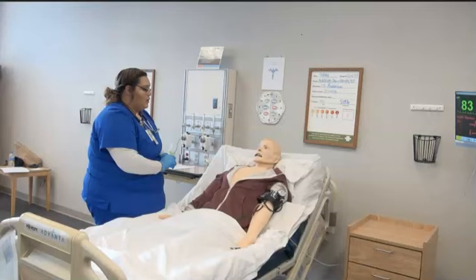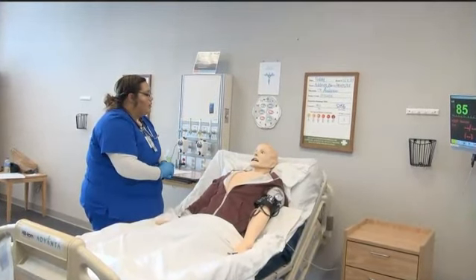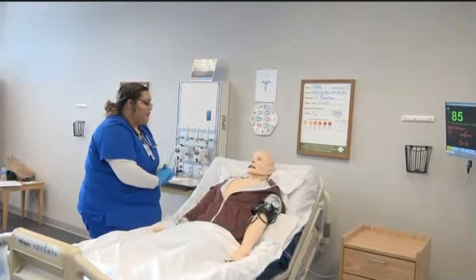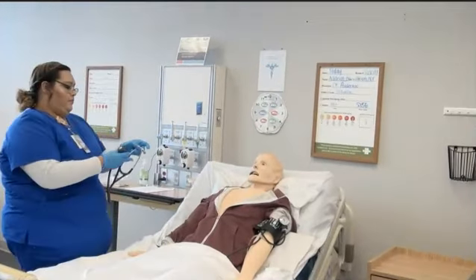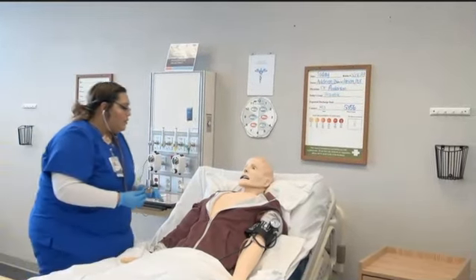Let's watch. So I'm going to listen to some breath sounds. I am going to look at your heart rate to make sure everything is appropriate before I set up your small volume nebulizer, okay? Okay. It's going to be a little cold, okay?